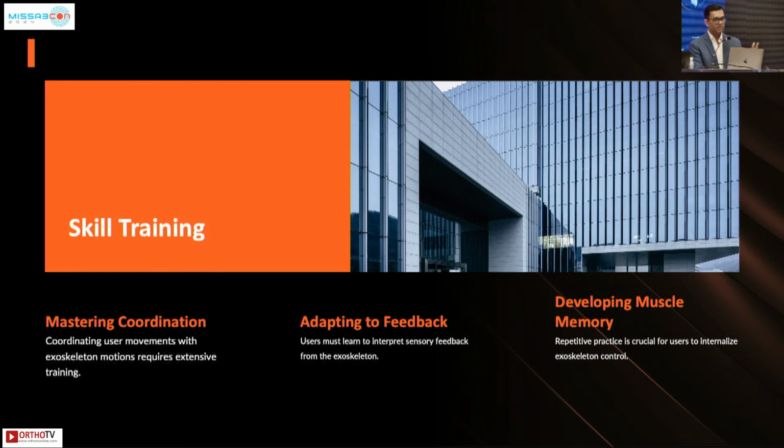Once you find it, you identify, you need a proper team who understands both the exoskeletal as well as the patient's capability, the patient's willingness to have this for a long period, because these come into several lakhs of rupees, and you cannot just buy one and use it for half an hour a day and just store it in your house. So it has to be something that's really useful for him on a day-to-day basis that he's going to use. So these are the skills training that has to take a lot of time, and the first thing we aimed at in these two patients is psychological training, whether he is ready to invest in this technology, in this money, so that he will use it.